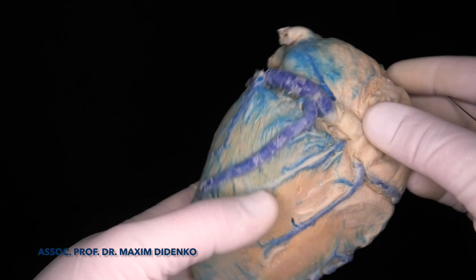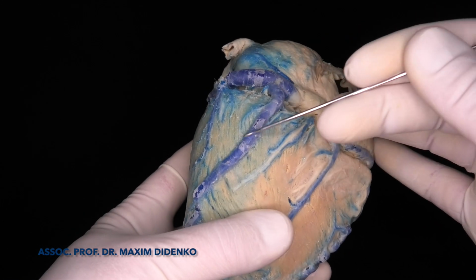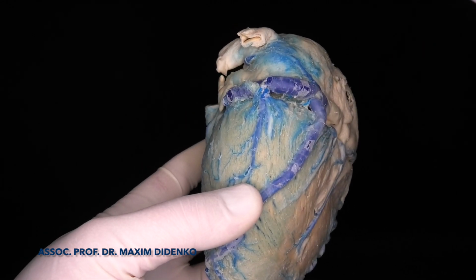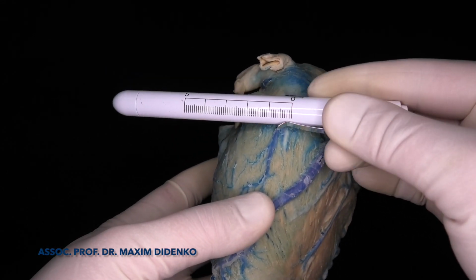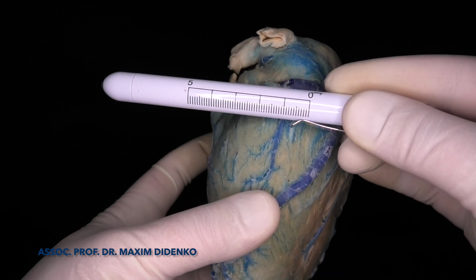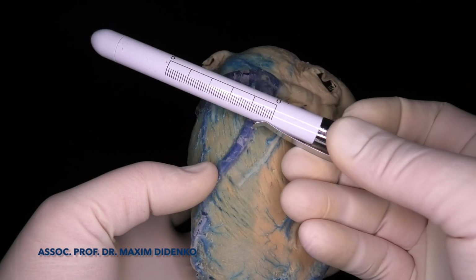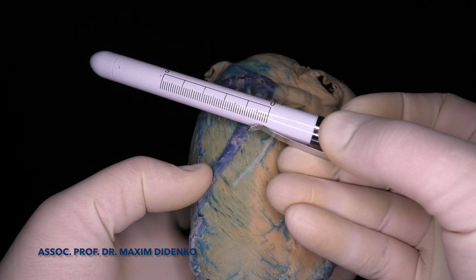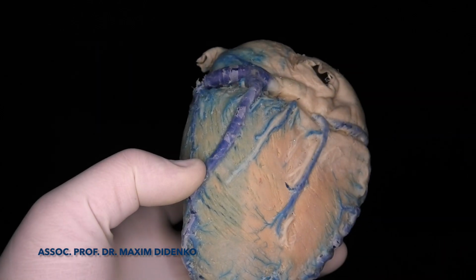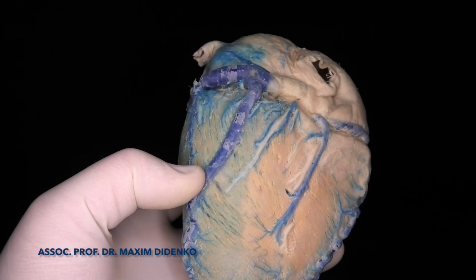You can also see the diameter of the veins. Some of them are really thin, and if we measure, it can be just 2 millimeters, or pretty thick with a diameter of up to 4 and 5 millimeters.